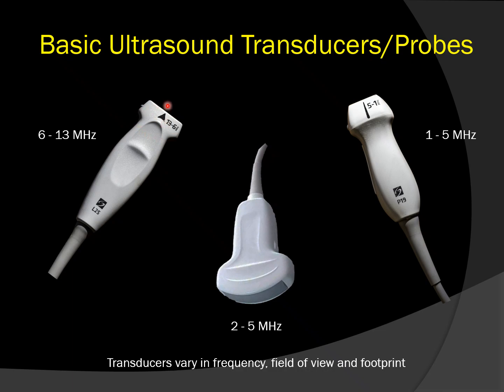These probes are different in characteristics. The high-frequency probe is wonderful to delineate different structures. However, high-frequency probes are subject to attenuation. That means the sound waves, unfortunately, do not travel very deeply. We can get about 5 to 6 centimeters deep using a linear high-frequency probe, but this is great for superficial structures, especially when we're doing our ICU procedures.